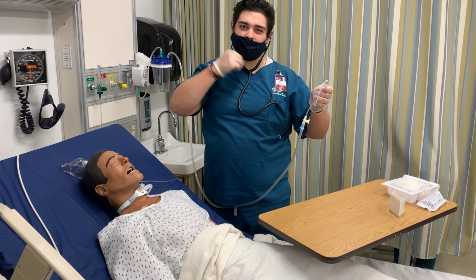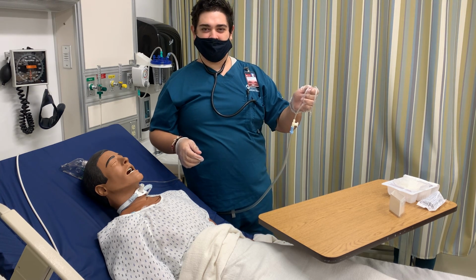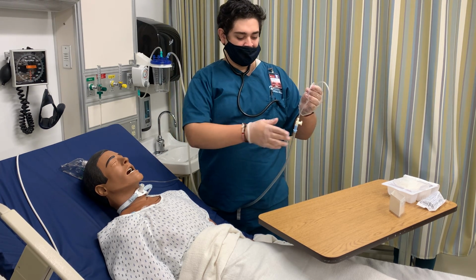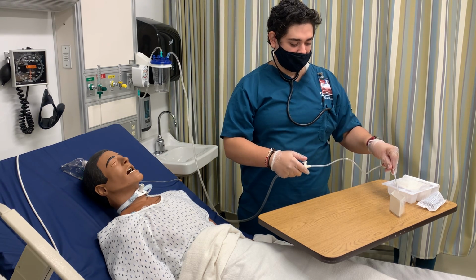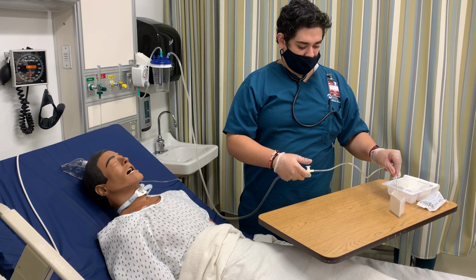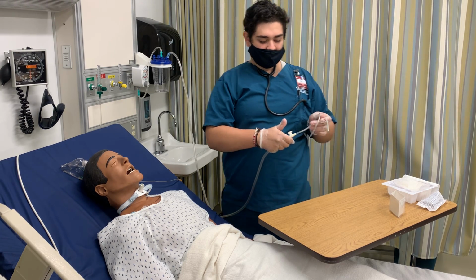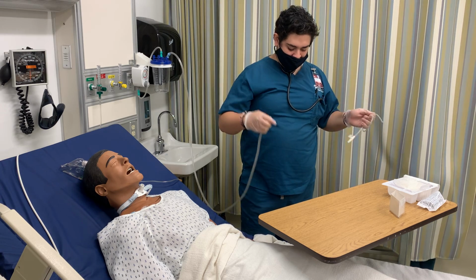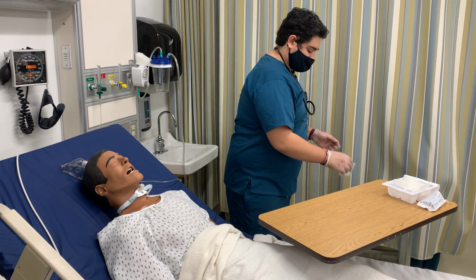And I did a full respiratory assessment on his lateral sides as well. And there is no need for further suctioning. If there was, I would have suctioned and cleaned out my catheter here in the saline boat. So I could just dispose of my equipment now. Put this into the trash.